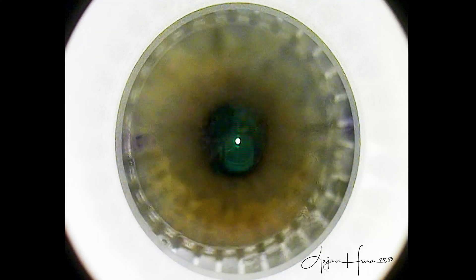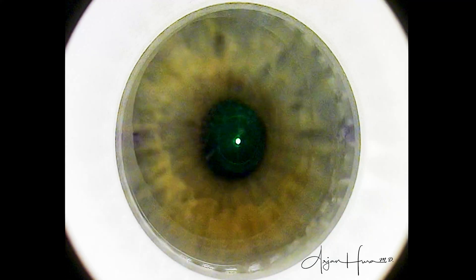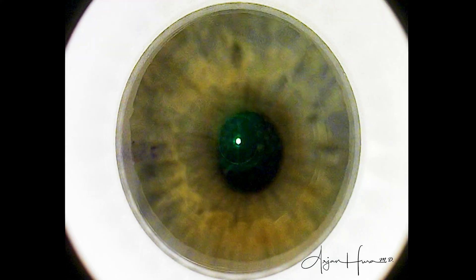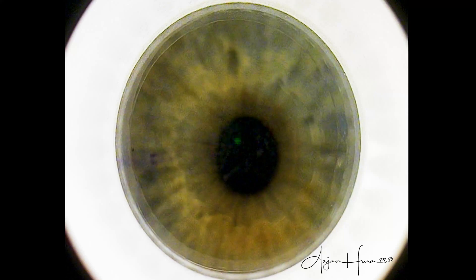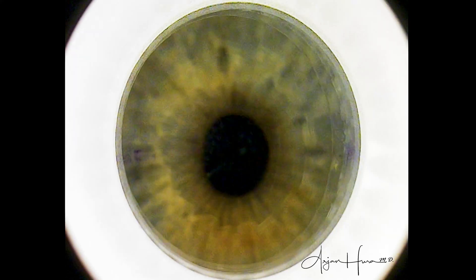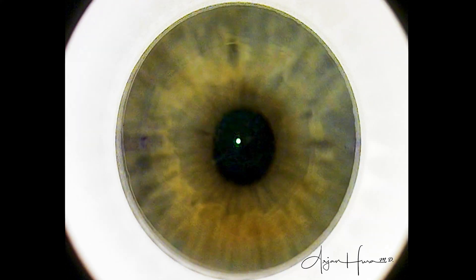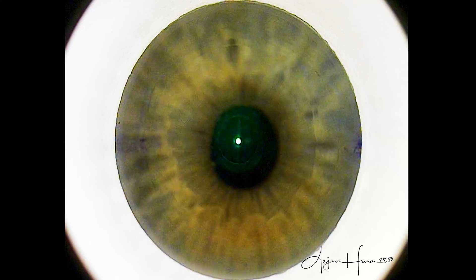In myopes, the visual axis tends to be slightly inferior, nasal, or infranasal. And while I'm making some small fine-tuned adjustments, you may notice some ink marks at the 0 and 180 degree positions. These are to help align the cone because the patient has a significant amount of astigmatism.